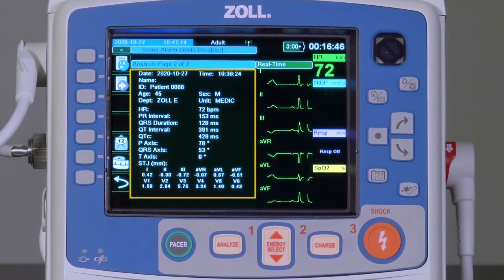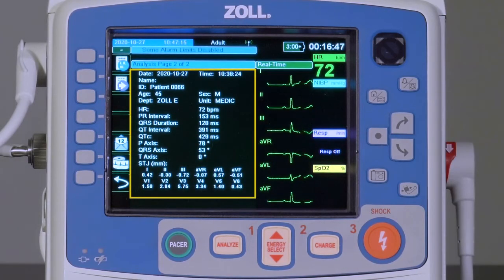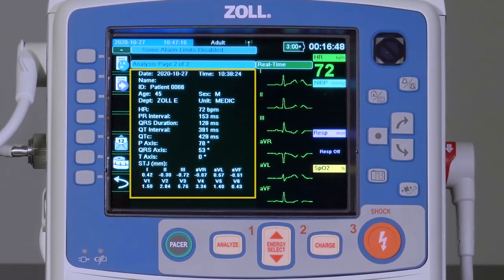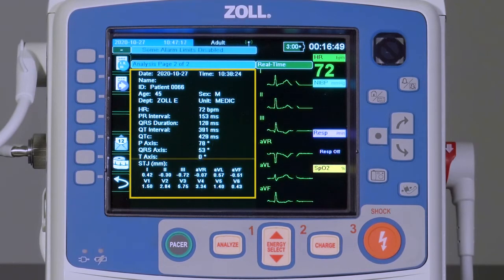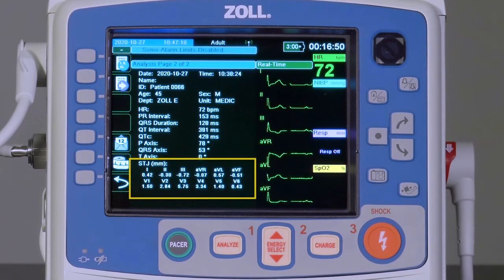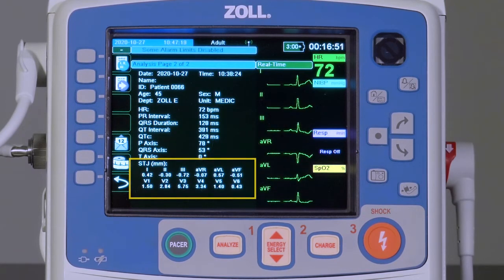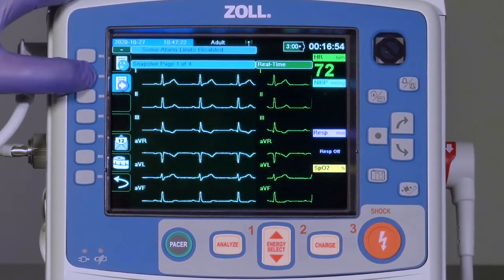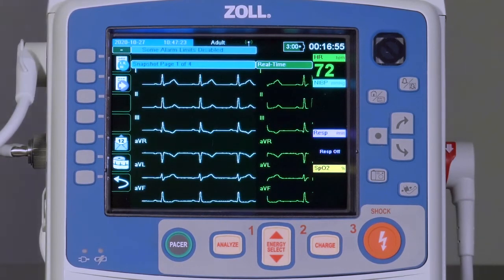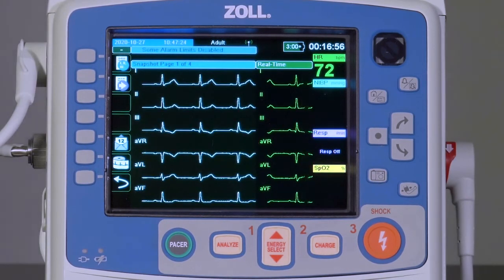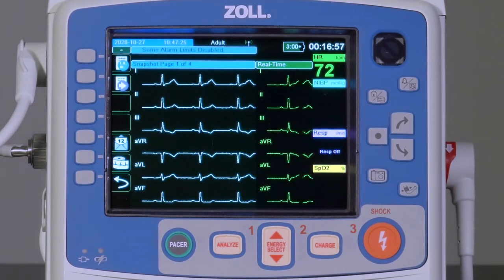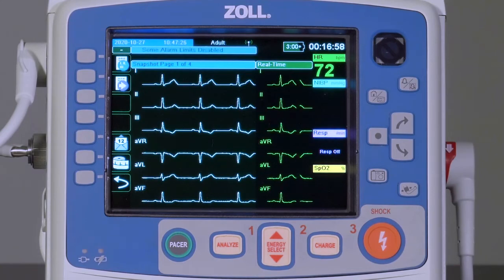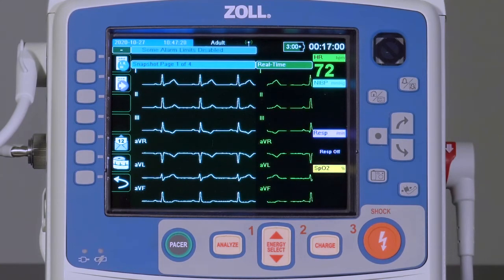This page provides patient information as well as related measurements, including STJ measurements. Pressing the 12-lead review next key a second time will display page 1 of the 12-lead ECG snapshots.